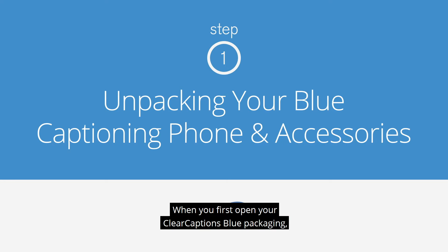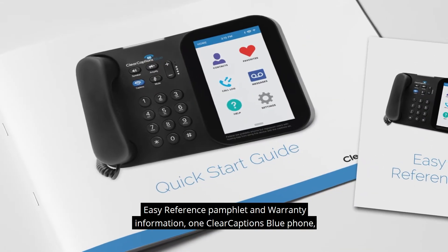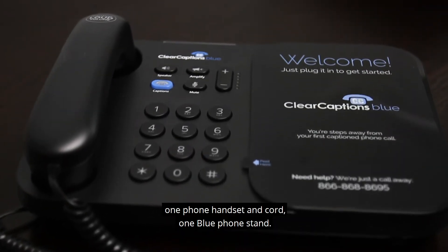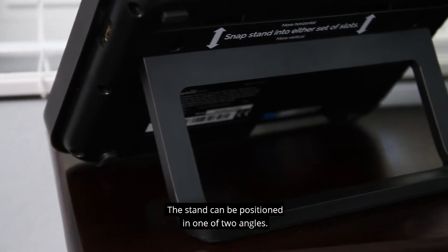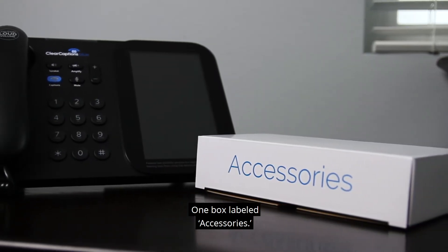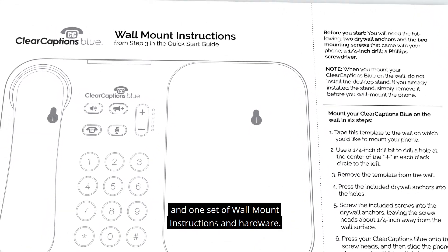When you first open your Clear Captions Blue packaging, you should find: one Start Here envelope containing a Quick Start Guide, Easy Reference Pamphlet, and Warranty Information; one Clear Captions Blue Phone, one Phone Handset and Cord; one Blue Phone Stand — which can be positioned in one of two angles; one box labeled Accessories; one Medical Release Form and Business Reply Envelope; and one set of Wall Mount Instructions and Hardware.